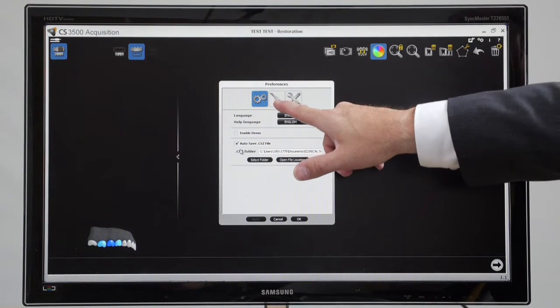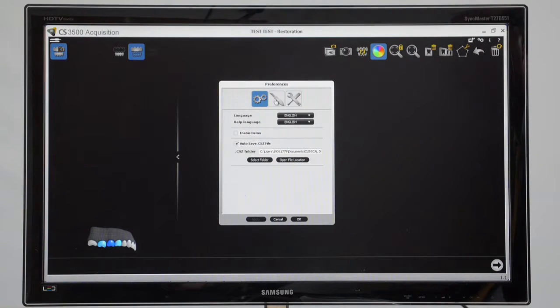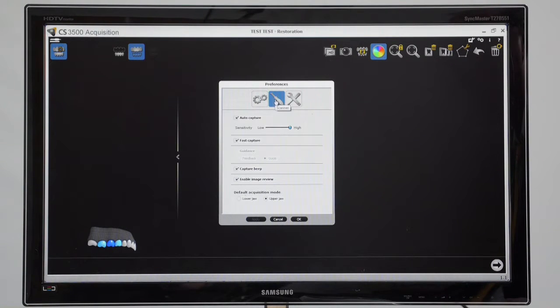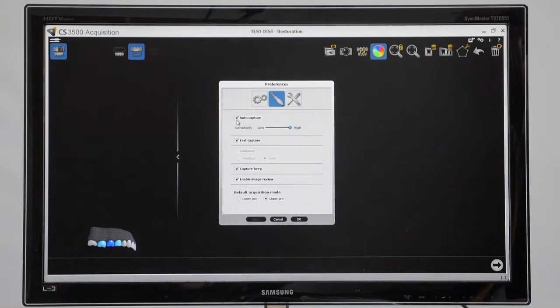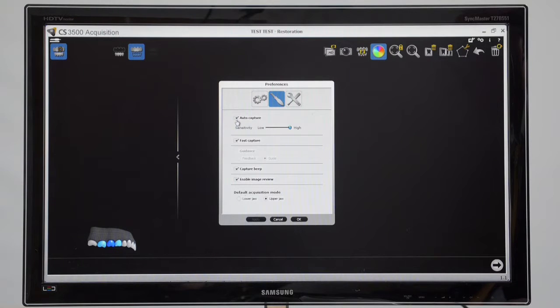Now I'll move to the central icon there and we'll just run through what these are and what benefits these are. So we have auto capture. As you know, you can scan using an auto capture feature.